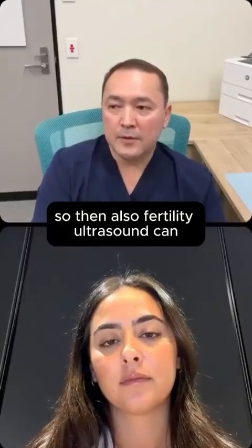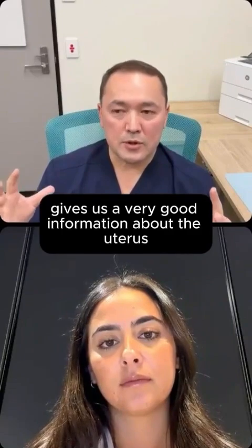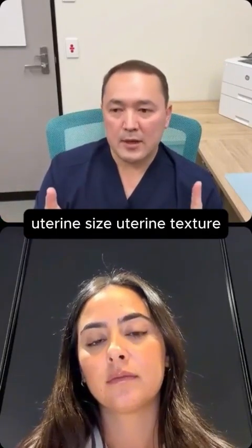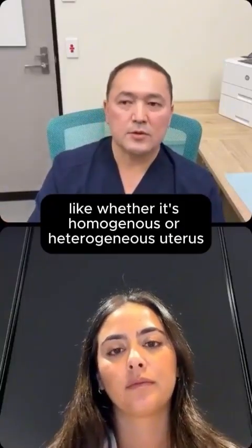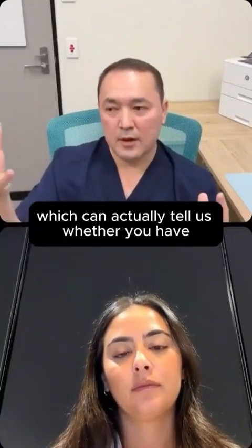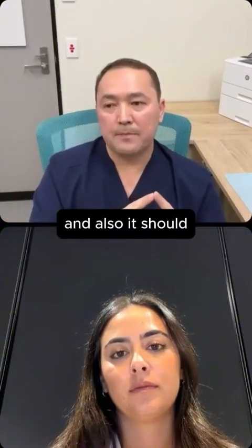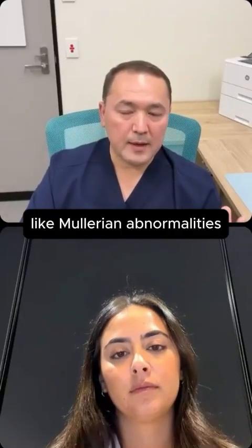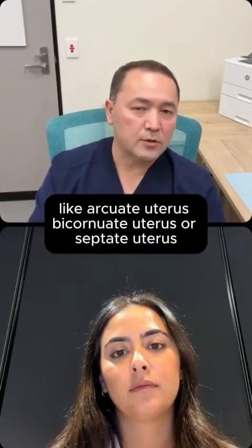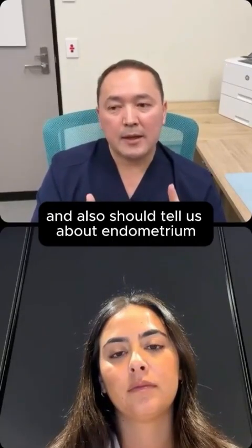Then also a fertility ultrasound scan gives us very good information about the uterus, uterine size, uterine texture, like whether it's a homogeneous or heterogeneous uterus, which can actually tell us whether you may have adenomyosis or not. And also it should tell us whether there's any abnormality in the uterus, like Mullerian abnormalities like arcuate uterus, bicornuate uterus, or septate uterus. And also it should tell us about the endometrium.